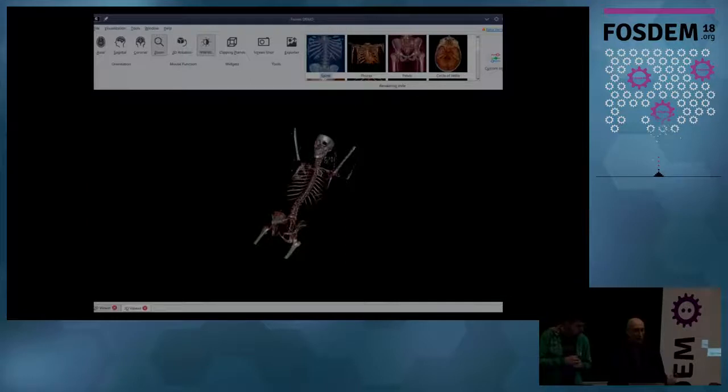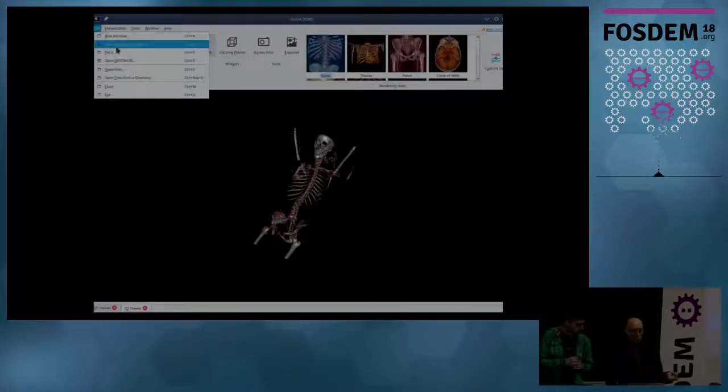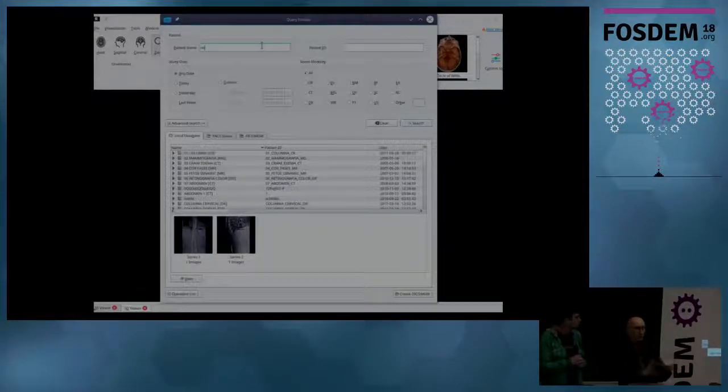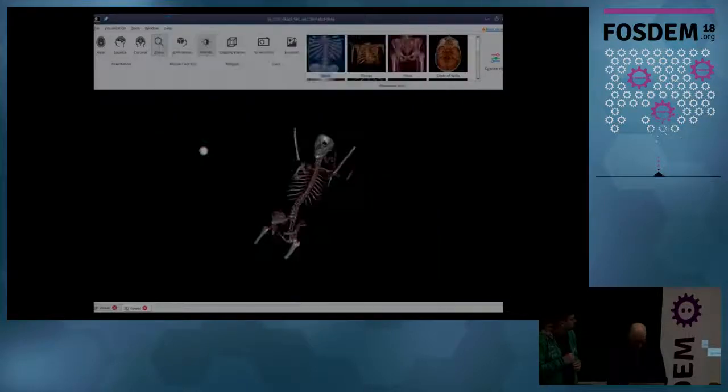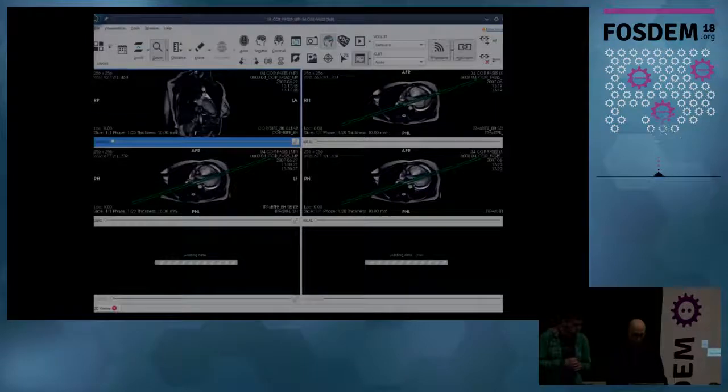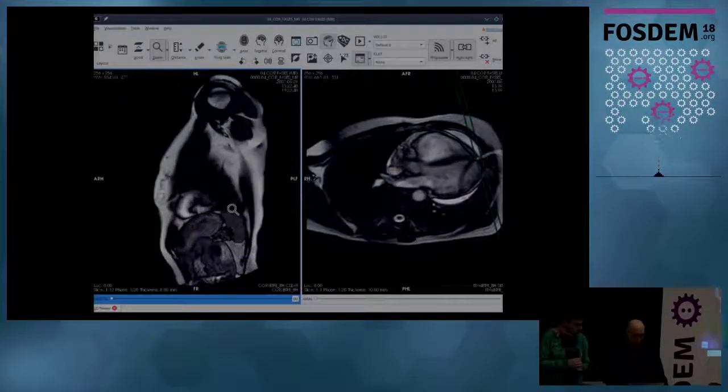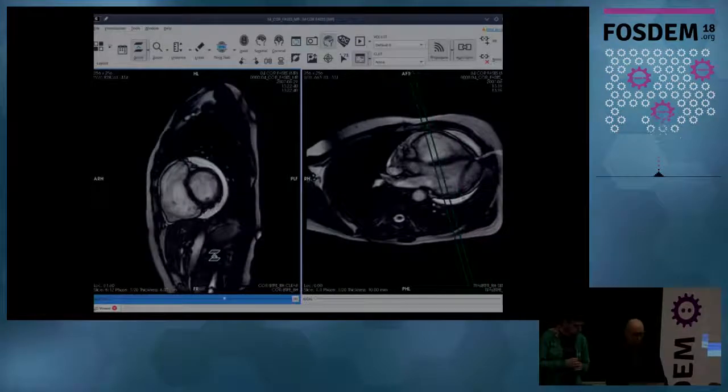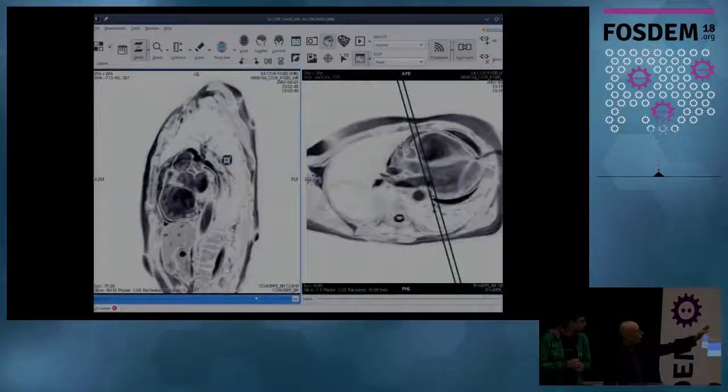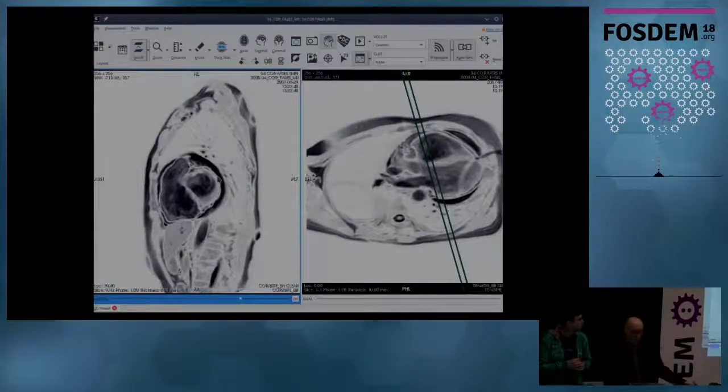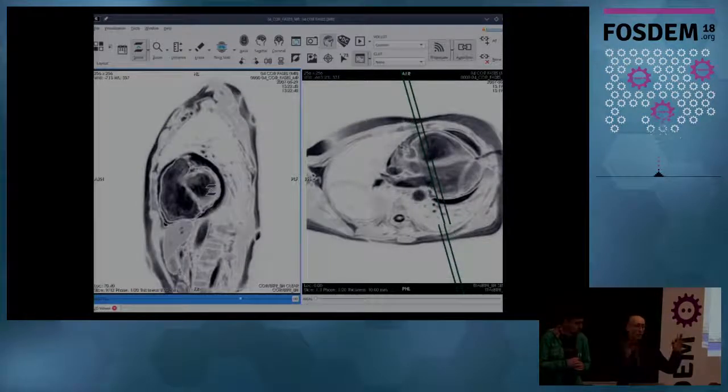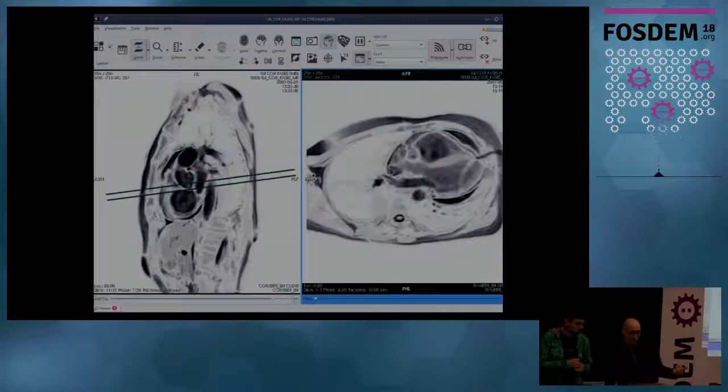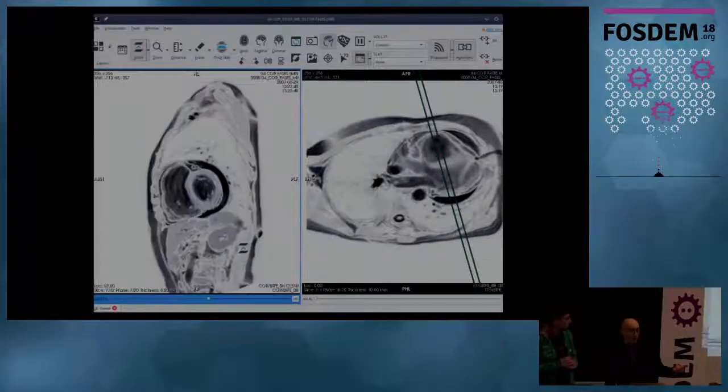Then, I showed what's called 3D volumetric data, but we can also have 4D volumes. 4D volumes mean that you have also time data, and this is the case of a heart magnetic resonance. This is the heart of a person. I will put two viewers, and here I will put this image. I can slice, I am changing the slice, you can see the reference lines. I will invert the colors. One is one series, another is another series, but because series have metadata, we can know spatially how is located one respect the other. And you can see the heart is moving. I will put play so you can see better how a heart is moving.